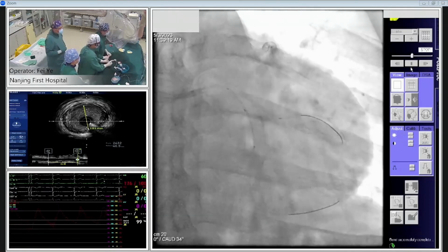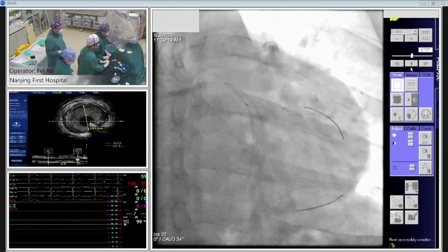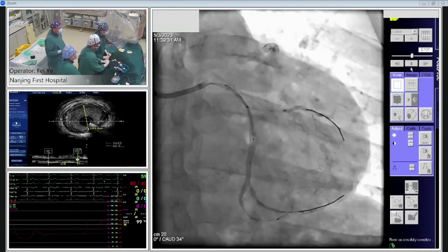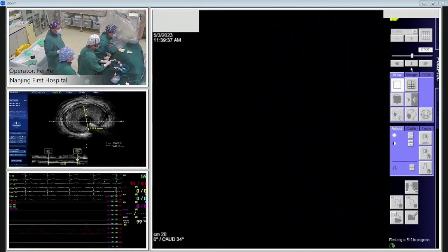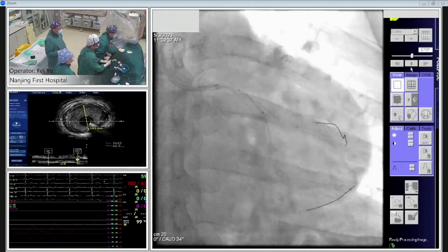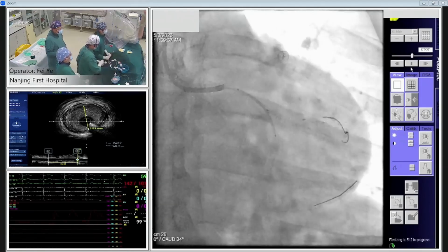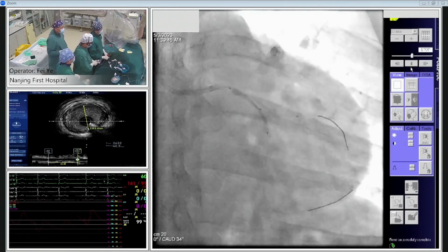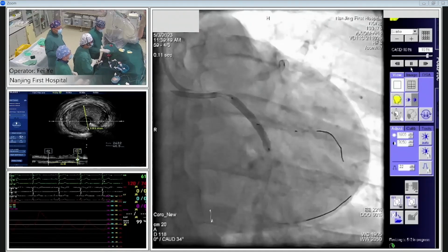Ready? No. Okay, send it. Okay, send it. Okay, now I think a little pull back is better. Yes, yeah, I think a little pull back is better. Overlap enough, yeah. Okay. Up. Fail. Okay, done. Nice.